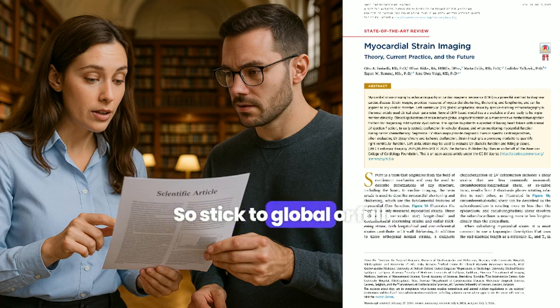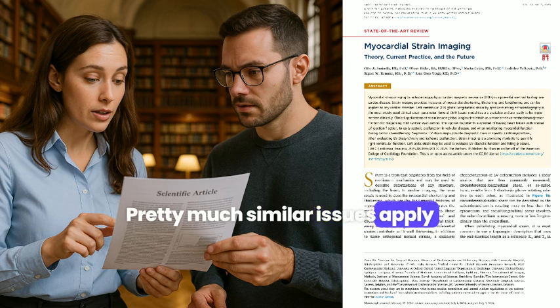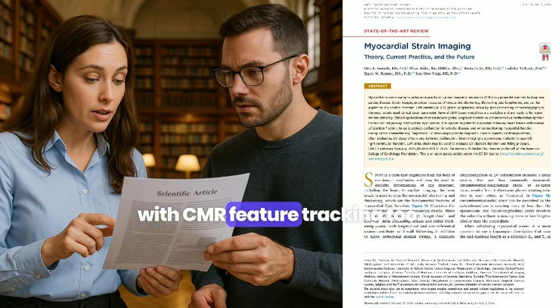So stick to global or full-thickness segmental for now? Pretty much. Similar issues apply to trying layer-specific stuff with CMR feature tracking too.